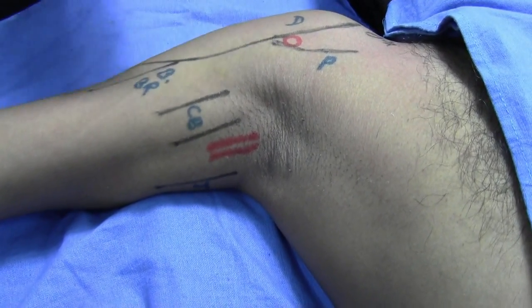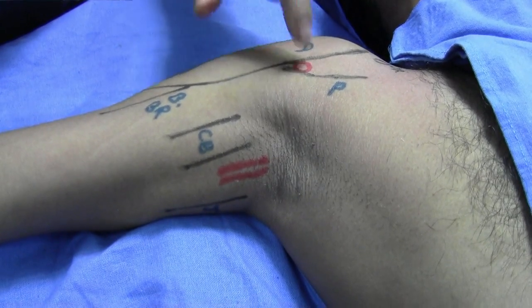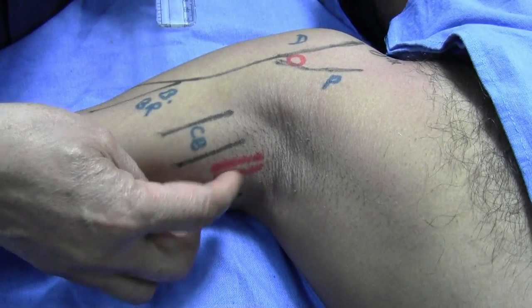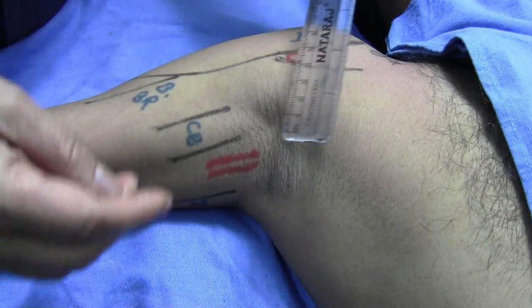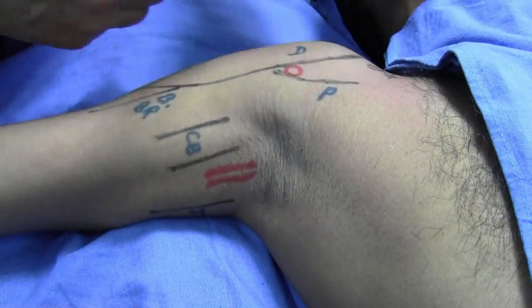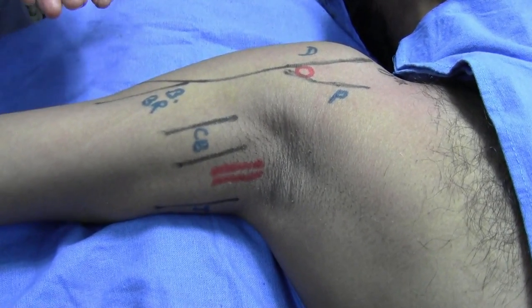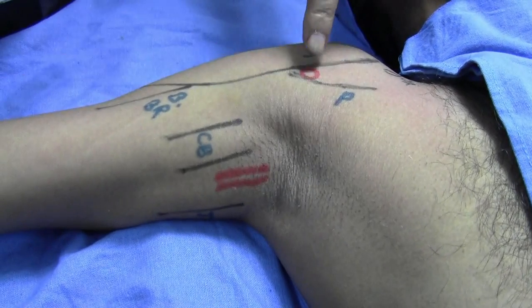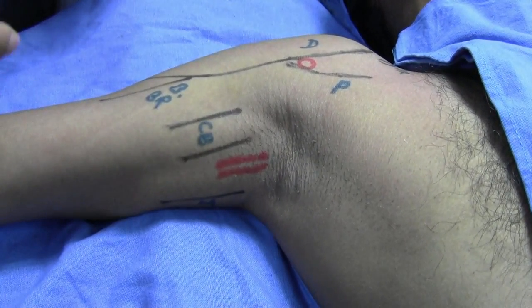The direct approach means inserting a needle at the apex of the deltopectoral groove, with the tip directed towards the marked brachial/axillary artery. In this adult patient, the distance from the brachial artery is about eight centimeters, meaning I need a needle about eight to ten centimeters long.